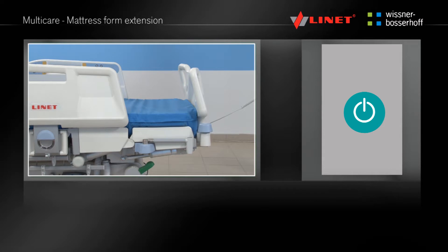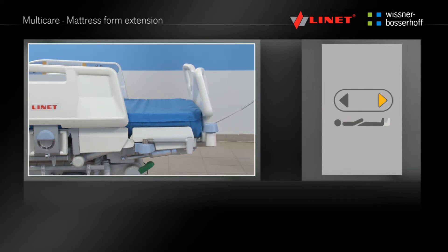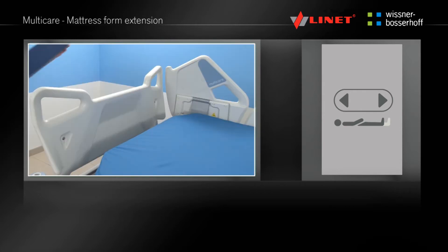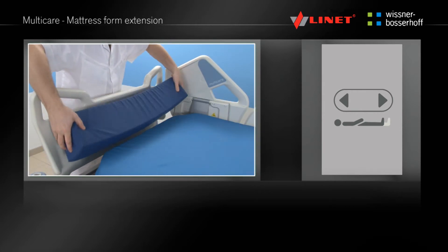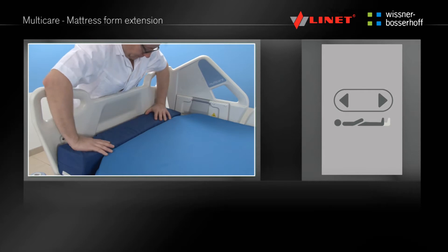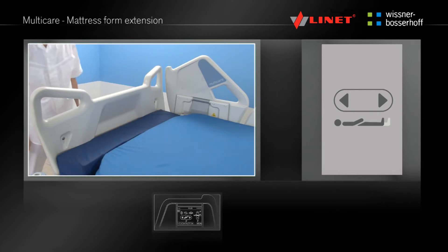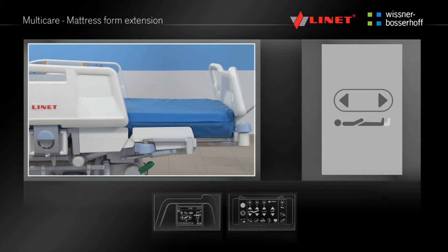Activate the function by pressing the Go button. Press and hold the function button until the desired length of the bed is reached. Slide the mattress towards the foot end and fill the gap near the head end. This function is located on the integrated side rail controls and the Supervisor panel.